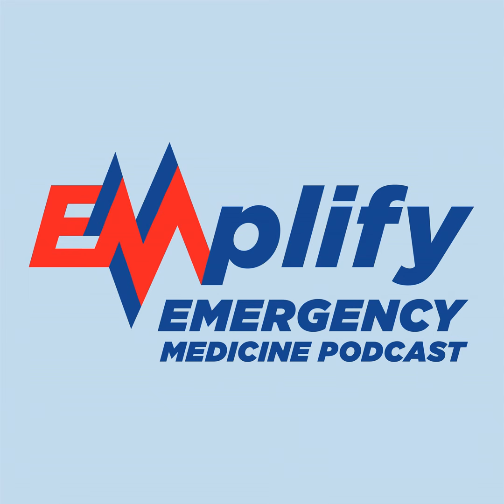And the main determinant, when you want to adjust someone's minute ventilation, should be respiratory rate. You should be using lung protective tidal volumes in basically everybody. And if you need a higher minute ventilation, which is respiratory rate times tidal volume, the main determinant of that change should be driven by a change in respiratory rate. That's primarily because the higher tidal volumes are associated with more barotrauma, where we're causing actual damage to patients' lungs, especially those who already have weak lungs to start with, have blebs and emphysematous changes and those kinds of things.